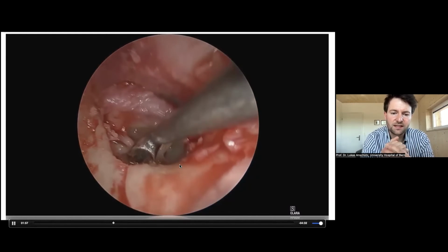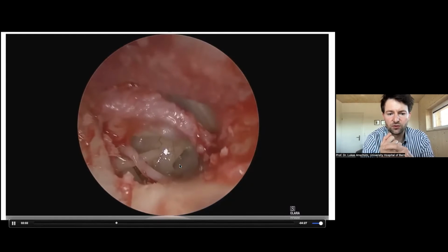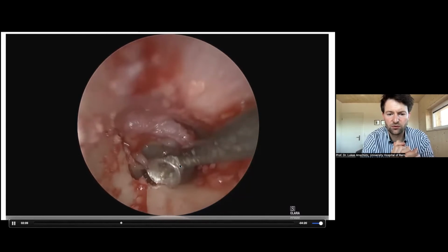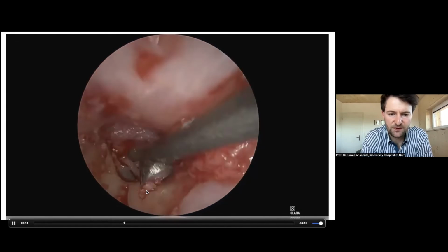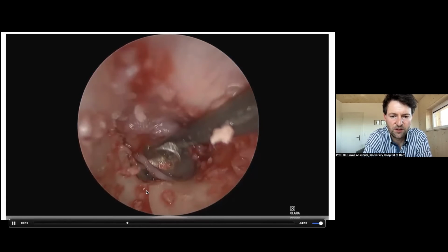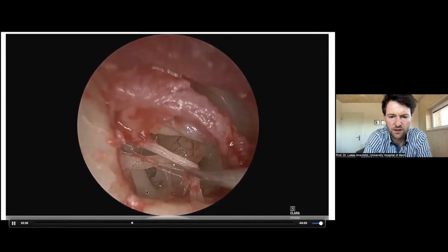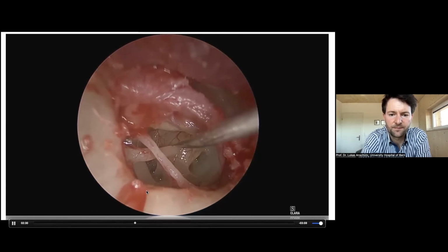Of course, with the endoscope, you can see very, very well, but you will also have to work. We need to do the stapedotomy. We need to position the prosthesis. So I remove a little bit of bone here of the scutum. You can do this with a curette, even if you see the curette is probably 50 years old or something like this. Even if the curette is not so extremely powerful, it is usually enough and you don't need to drill. Now the neurolysis of the chorda, and now we can see the different ossicles.